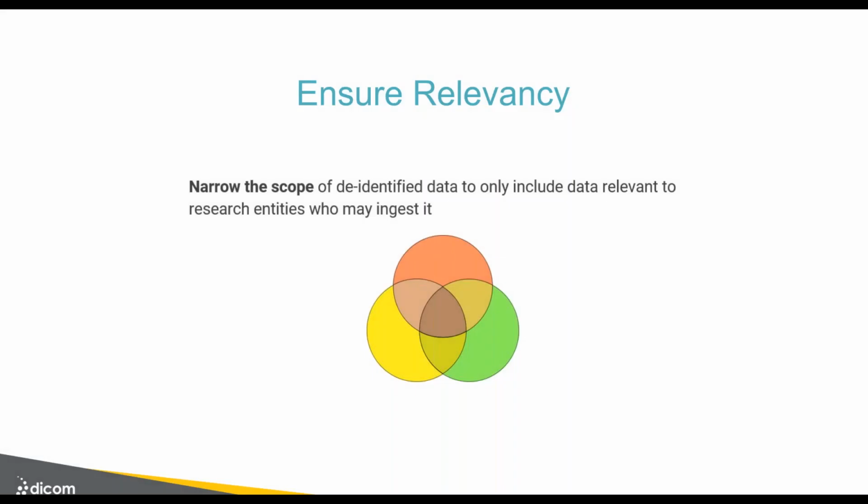Yes, sorry to throw you off kilter there, but I think there's an interesting problem that I don't think the industry has solved yet that is worth mentioning in the de-identification project. We take so much care to de-identify metadata and mask embedded data in some of the images. Yet, if you take a stack of coronal or sagittal images and put them all together, especially if you have thin slices, and you turn it into a 3D image, well, the ultimate identifier, somebody's face, could be recognized, right?